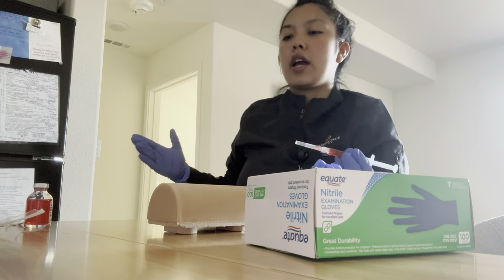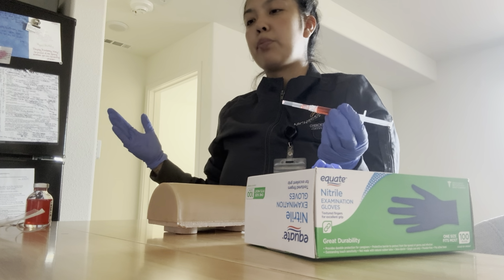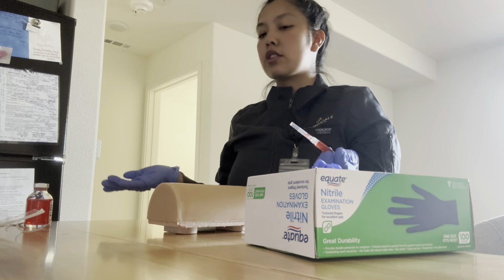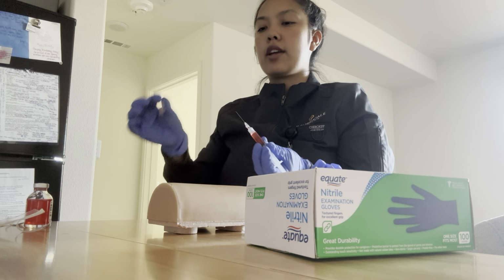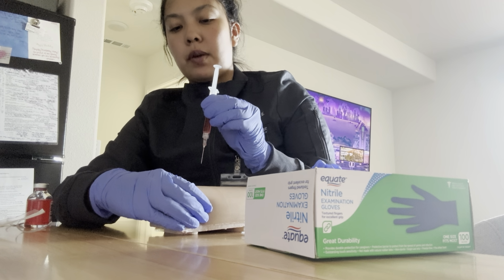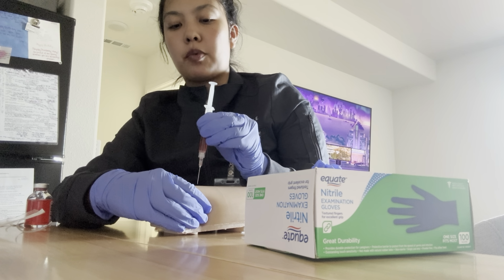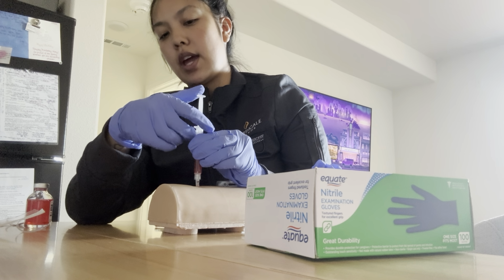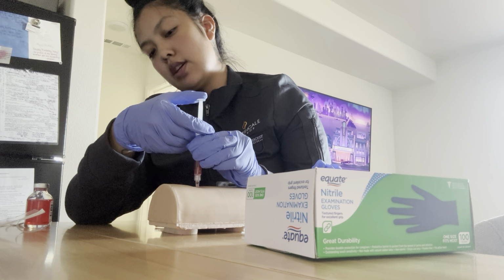Okay, and now with this one, we do aspirate. So you might feel slight burning and slight stinging. It might feel like there's something in your arm, but just go ahead and talk to me and we can get this show on the road, okay? I'm going to uncap now, and make sure my bevel is up. I'm going to inject at a 90-degree angle while squeezing the patient's arm and talking to the patient. I'm going to insert and then aspirate. And now I'm going to inject slowly.